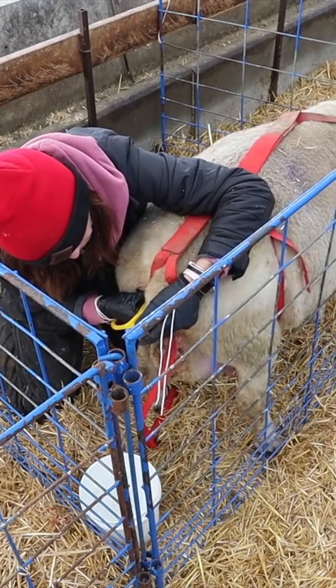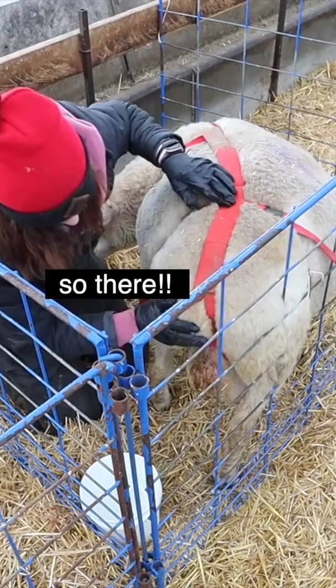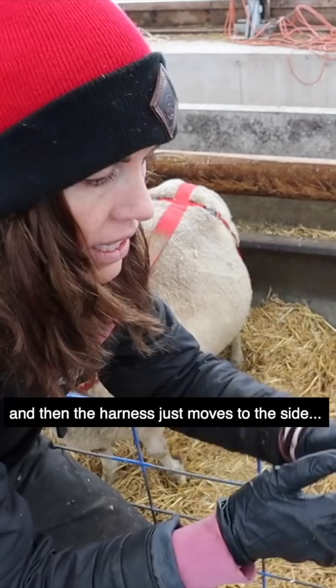It should go right in. Put it under the harness best you can, and then what I do is there's little strings on the sides of the spoon and I just tie them. There she is, all in. The lamb will nurse right through that — the lamb will spit out the spoon and the harness just moves to the side.